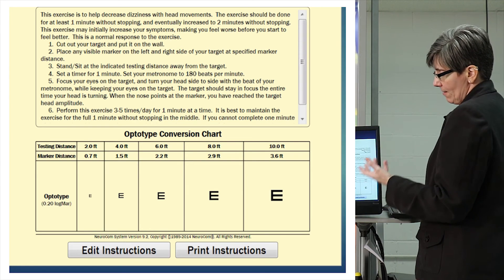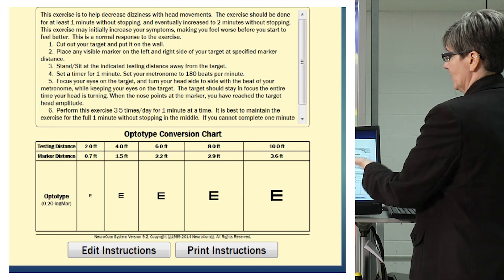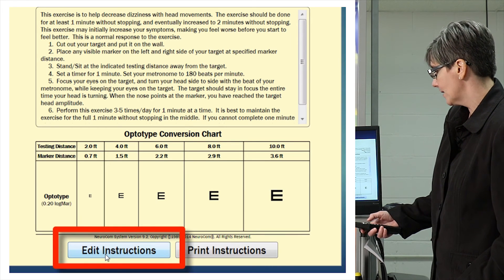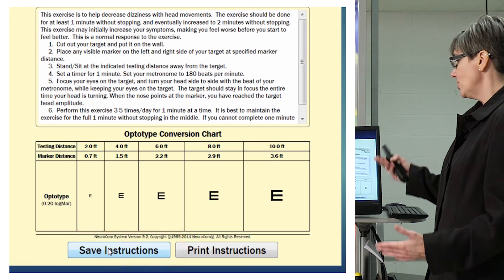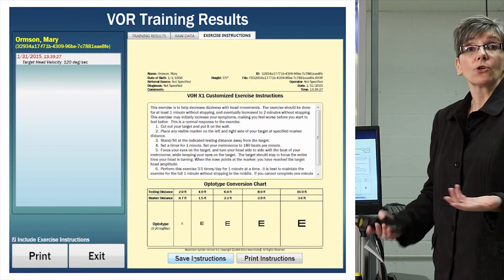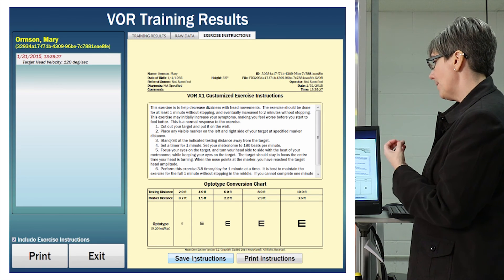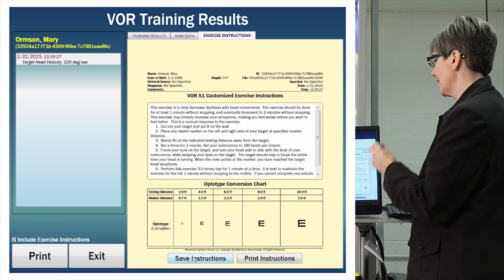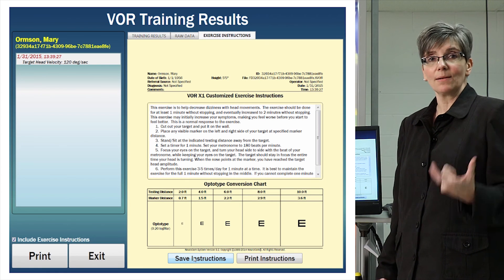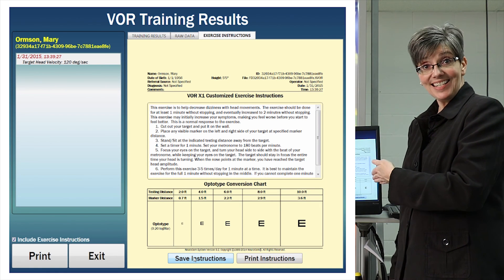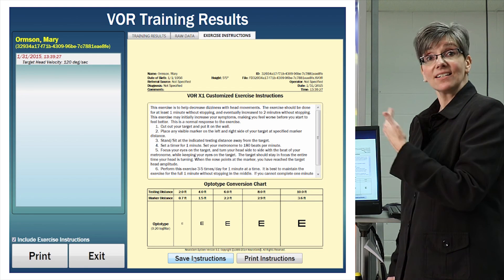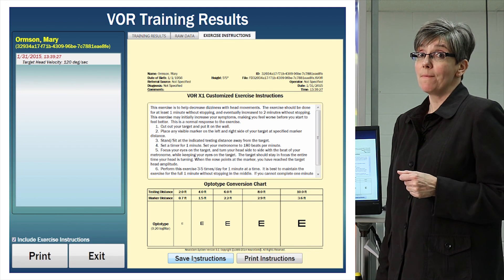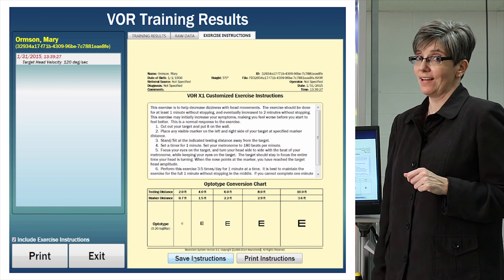If your therapy clinic performs exercises differently than indicated on these instructions, the exercise instructions are completely editable — click on 'edit instructions' and you can modify them for your own clinic use. The instructions also give the patient the opportunity to set their metronome based on the exact point of retinal slip determined during GST testing. As training advances and we save the exercise, that updated instruction will carry over for GST training and appear on the patient's exercise instructions.